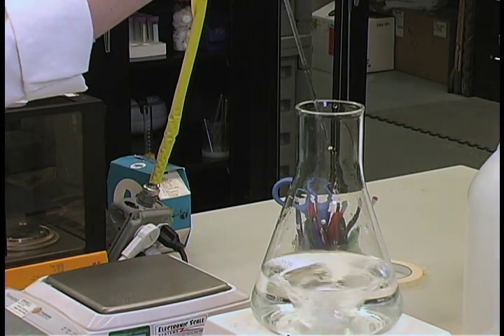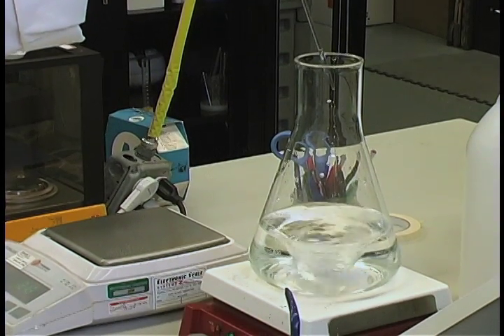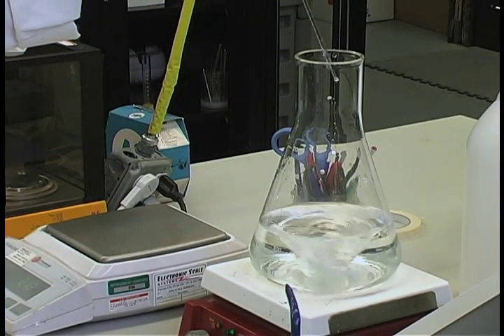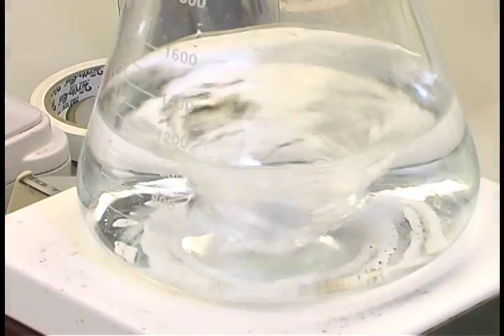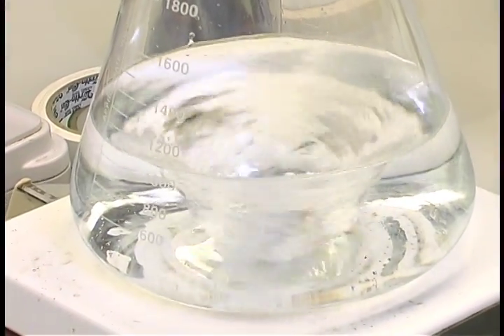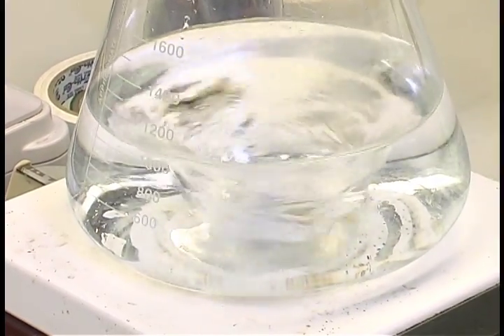Most vitamin stocks are added at one mil per liter of medium prepared. Most plant growth regulator stocks are added at one mil per liter to achieve a final concentration of one milligram per liter of medium. Always check the product label to determine the proper concentrations.